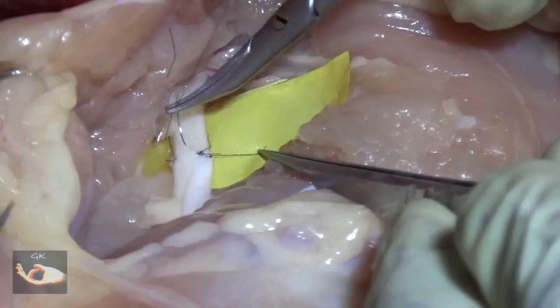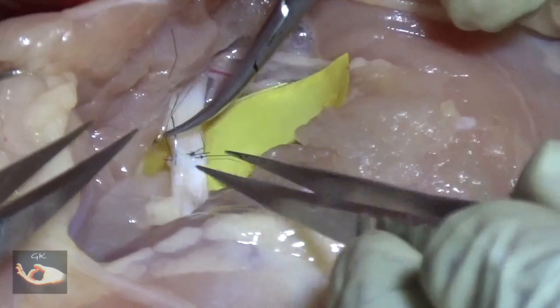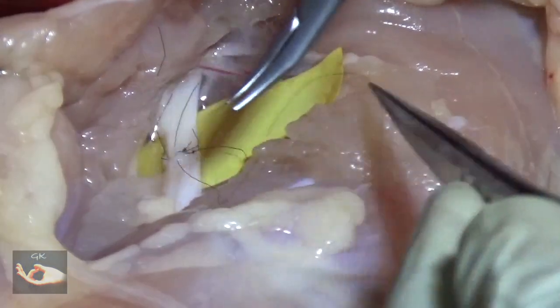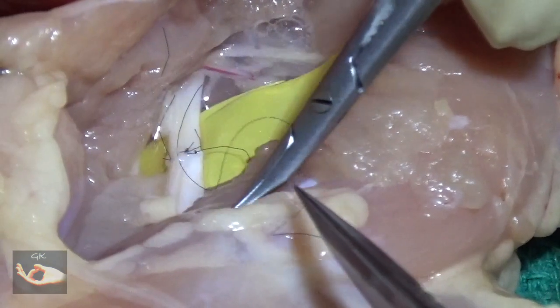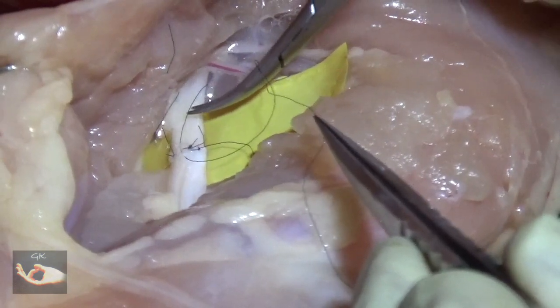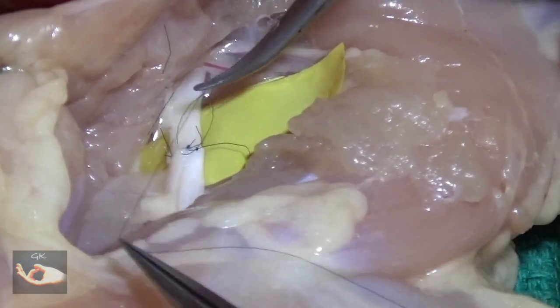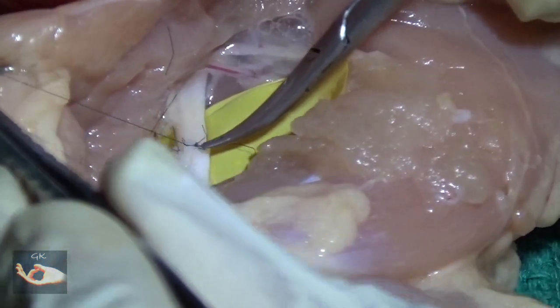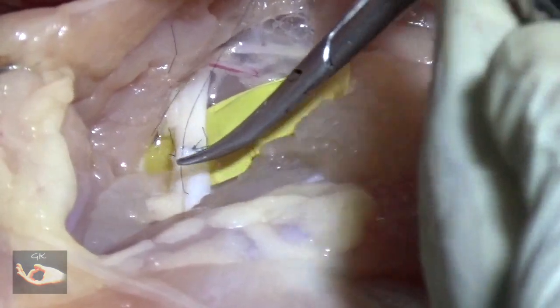The rest of the nerve is repaired as already elucidated. Successful results in peripheral nerve surgery come from perfect technical concepts, understanding the biology of the nerve, understanding the process of wound healing in the nerve, and using good surgical instruments. Patience and good practice will definitely go a long way in achieving good results in nerve suturing and nerve surgery.